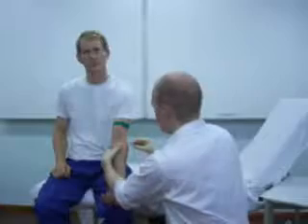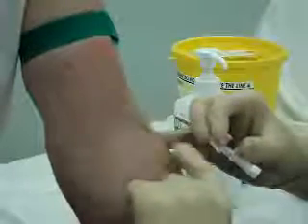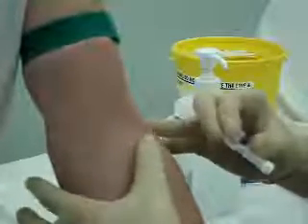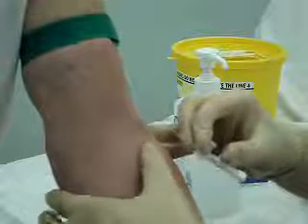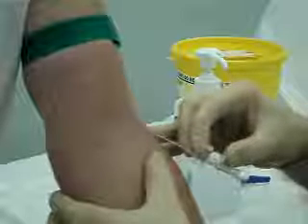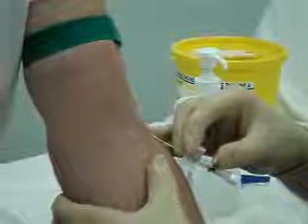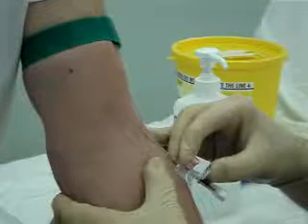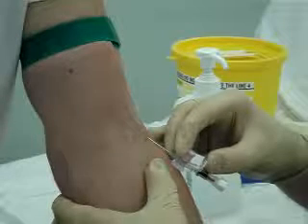Okay, so again, all of these things. You're just going to feel a sharp scratch in just a second. So when I'm approaching the vein, I've got the line of the vein clearly described. I'm going to just tighten the skin slightly using my ring finger and thumb. Again, I'm not touching anywhere near the actual insertion site. And then once I've got the line correct, at about 30 degrees, I'm just going to gently and firmly insert the cannula in. You can see there straight away, just gone through the skin, the flashback into the bevel of the cannula. At this stage, drop the cannula down nice and flat, and then insert it maybe a millimetre or so.